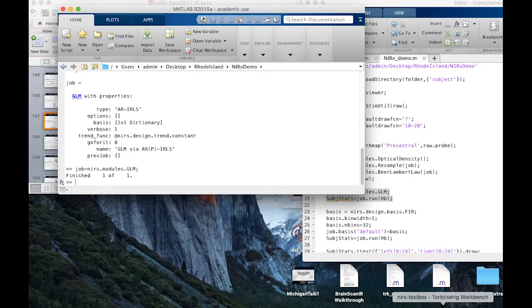It's unique to time series analysis. There are other ways to do the block average. When you do regression, your noise is estimated from the residual of everything that wasn't part of the model. When you do a block average, your noise gets estimated for each time point individually, and so it's a little bit different. It still does have these problems.